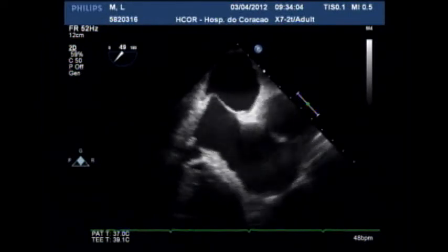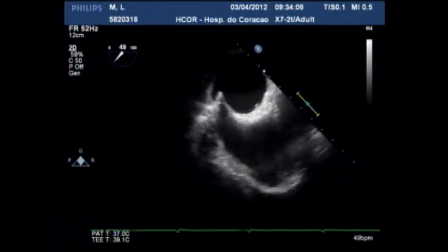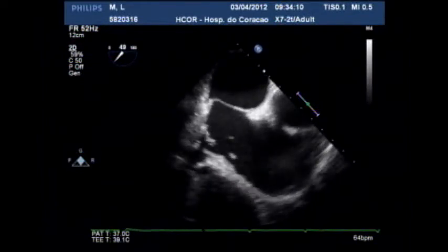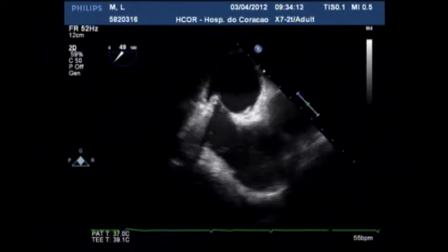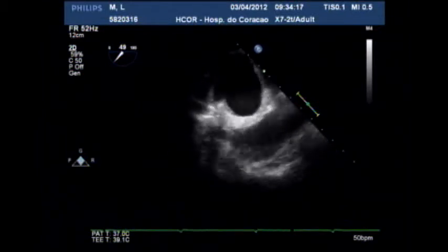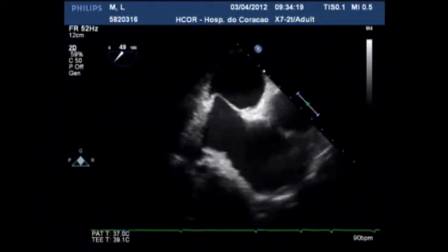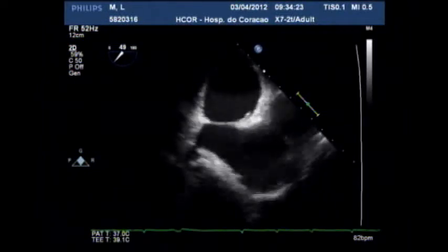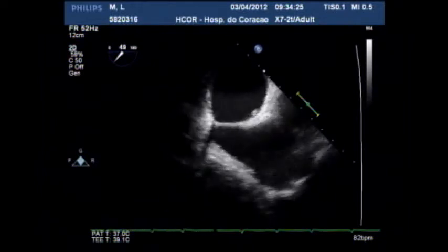Okay, I advanced the needle. I'm going to inject some dye. Not yet, though. I'm feeling some resistance. So I'm tenting the septum. I have to use some brutal force here. Not a problem, because I think I'm in the right spot. So you can see the echo there. So it gave. I felt a give. So I'm in the left atrium.